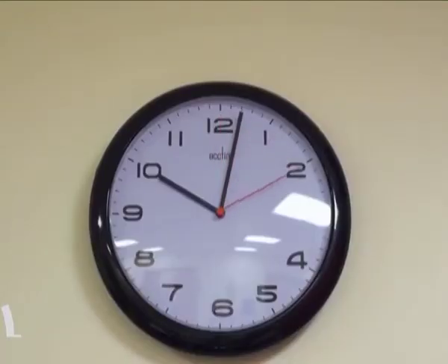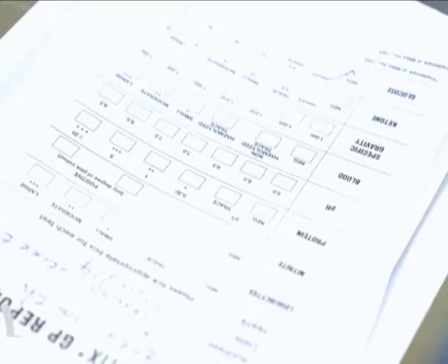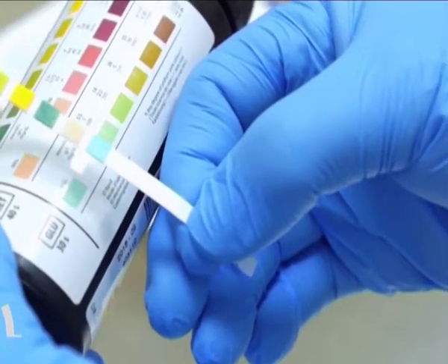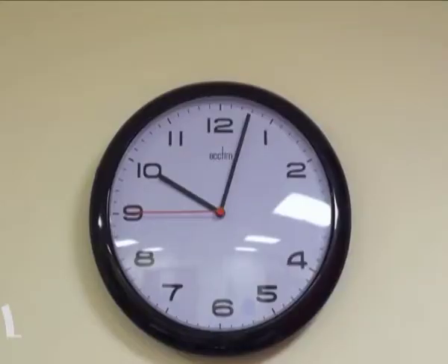The degree of color change on a test pad can give an estimate of the amount of substance present. For example, a slight color change in the test pad for protein may indicate a small amount of protein present in the urine, whereas a deep color change may indicate a large amount.